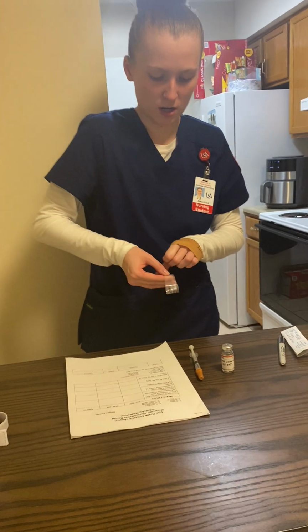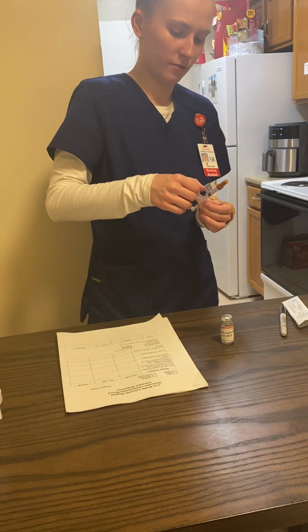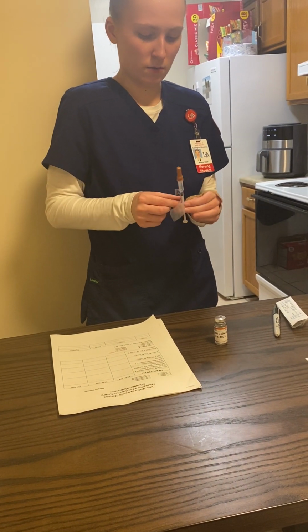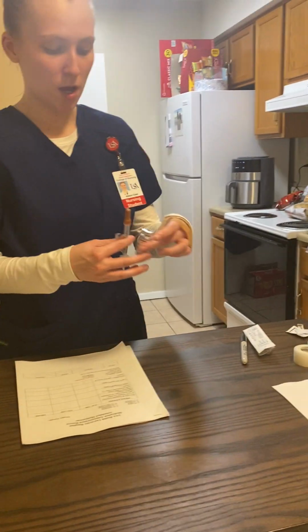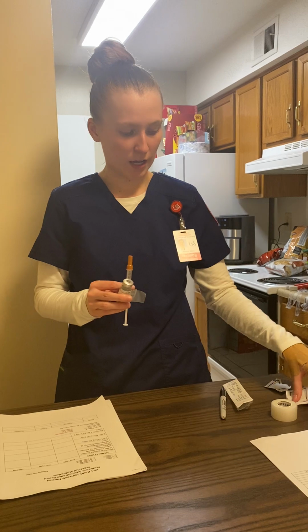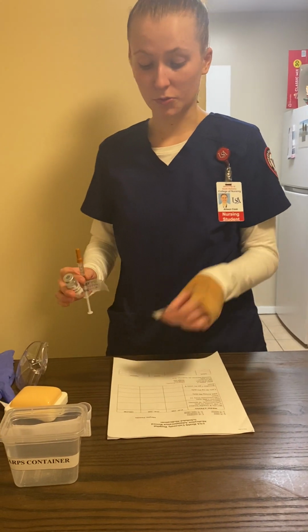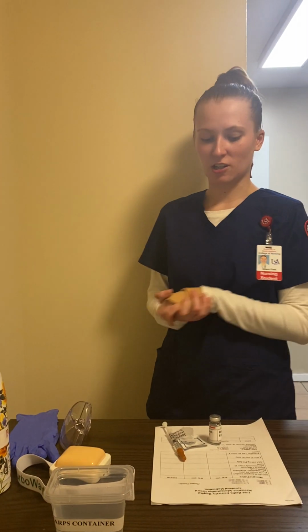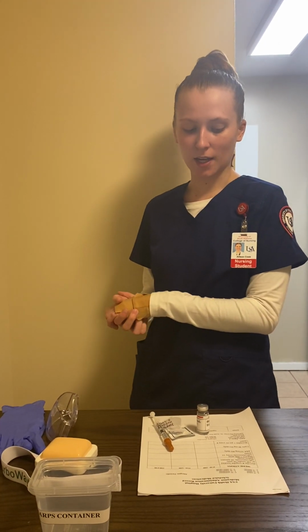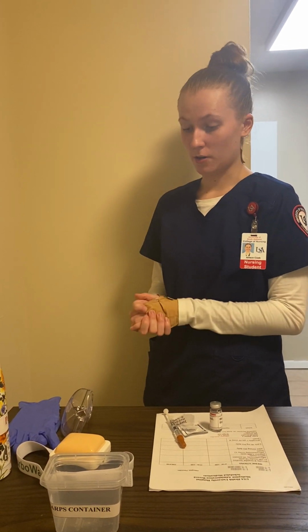So I'll be putting this on the bottom half of the syringe so it does not interfere with the dosage. All right, so I'm gonna go ahead and bring my vial, my syringe, a clean alcohol pad, and my MAR to Mr. Jones's room. Hello, Mr. Jones, my name is Allison, and I will be your nurse today. I will be administering heparin.